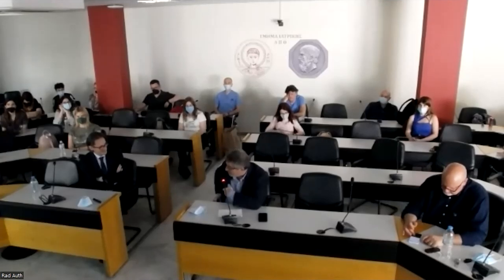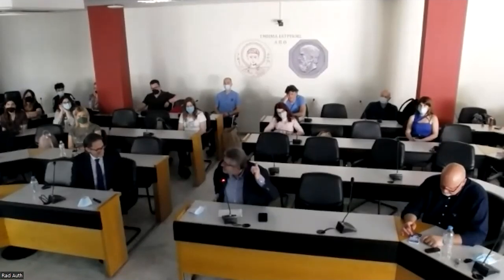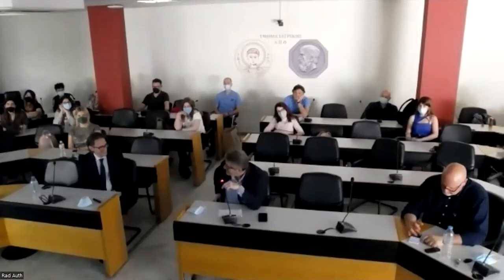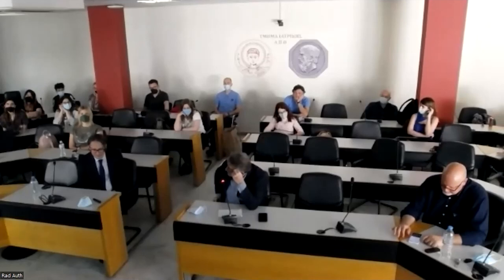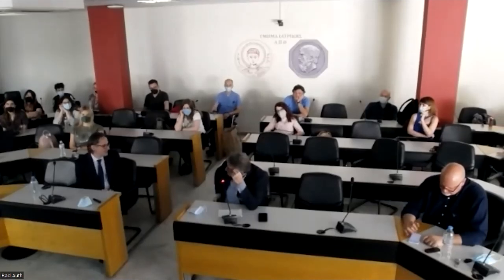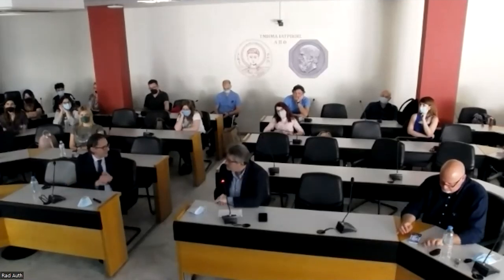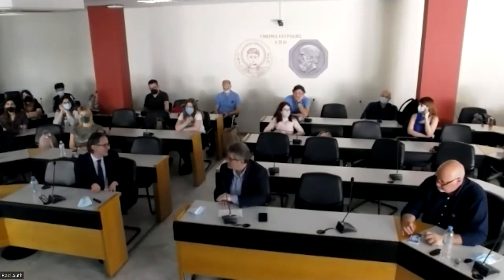Because we are buying a new CT. As you told, this is an old type of CT. But imagine someone who will buy a 320 row CT, that you call an old one. Is this the future of CT? To be honest, this is not the future, because this is the state of the art. Today, we should have, if it is possible, a spectral CT, but the future is the photon counting.